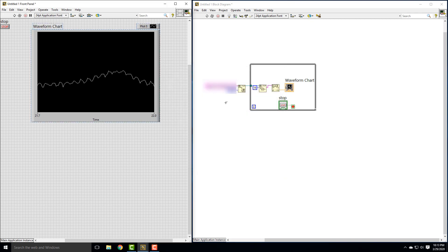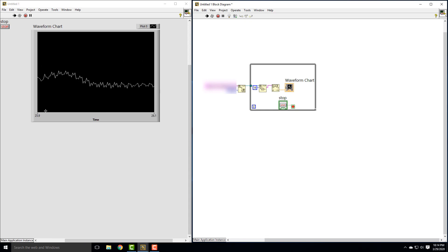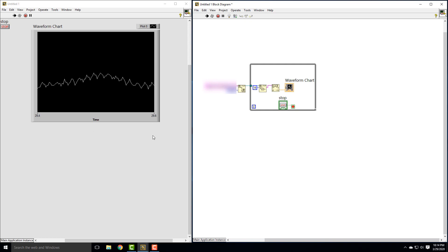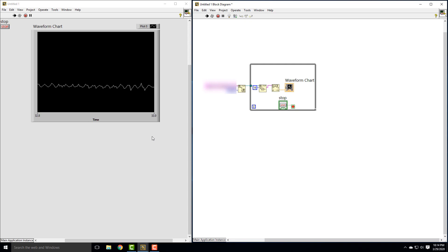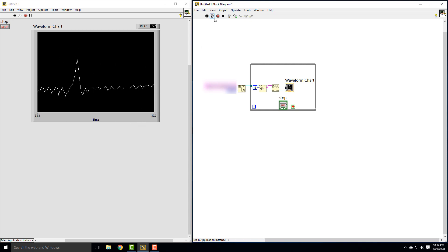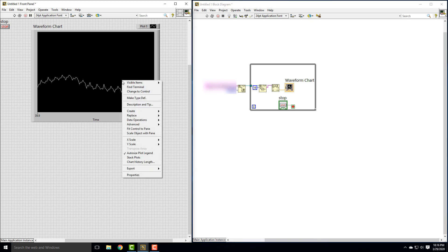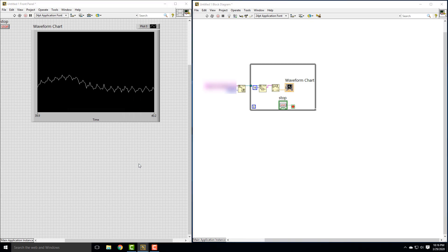Let's go ahead and run this again. Now it looks more reasonable — we can start to see this ECG pattern flying by. It has a lot of noise because the data I collected was just with an instrumentation amplifier with no other signal conditioning going on. This is still not looking like a great ECG. So let's say we want to include more points — we can right-click and do chart history length. Right now it's set to 1024 points.